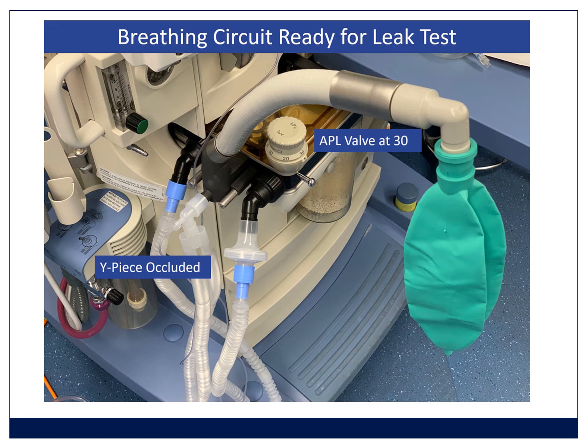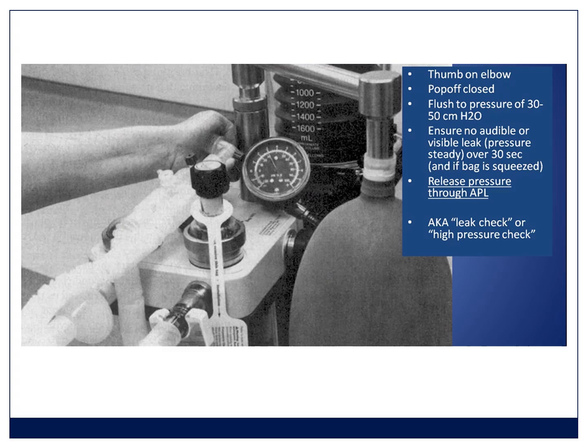Here is another way of doing it. So the Y-piece is occluded. You can see it's plugged in. This is a Drager machine. The APL valve is set to 30 in this case. And you can run your leak test like we told you, but actually these machines will do it for you. So you say, I'm going to run a leak test. It then fills the circuit with air until there's a pressure of 30. And then it works out how much air do I need to put into the machine to keep the pressure at 30. And depending on how much flow is needed, that's how much the leak is. So that's the other way of doing this.